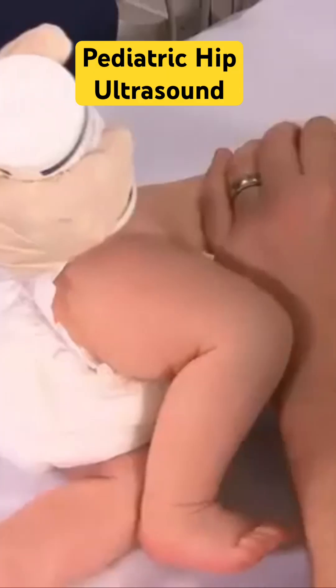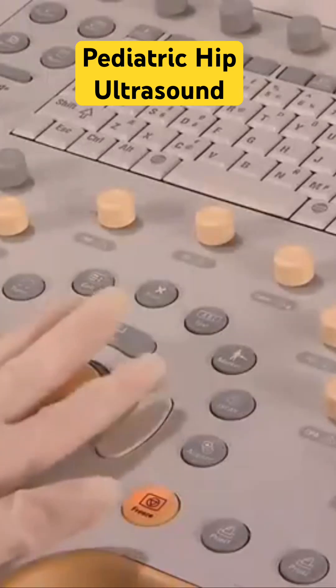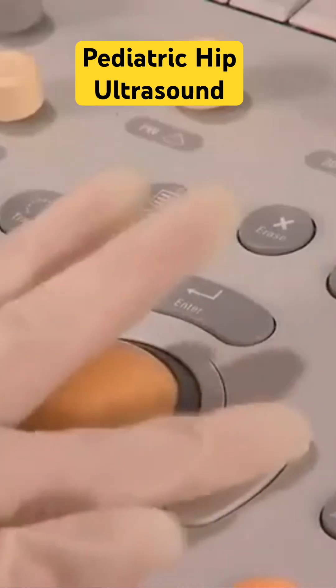Apply pre-warmed acoustic gel to the area to be examined. Confirm the correct transducer setting and presets.